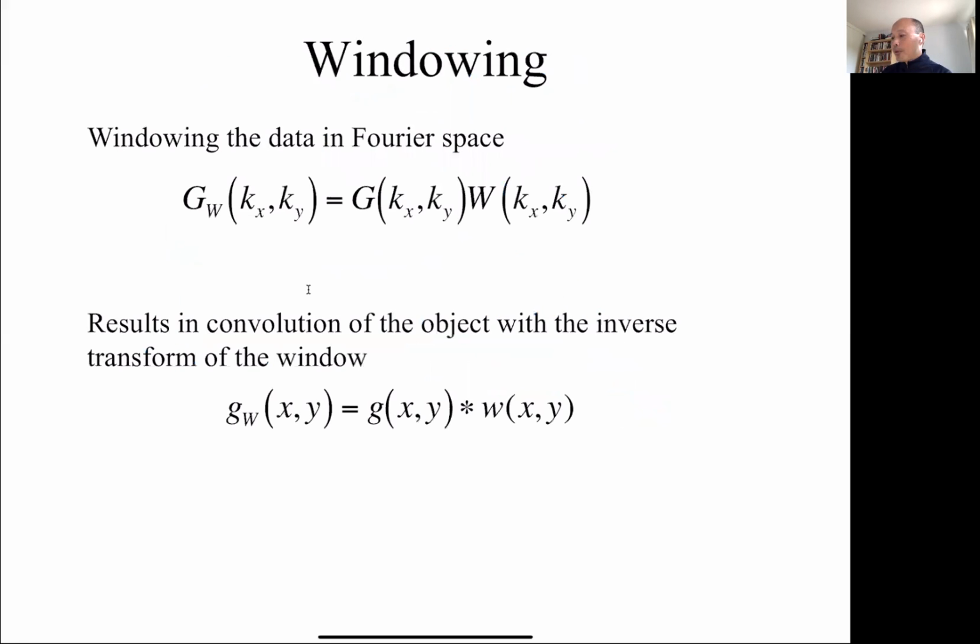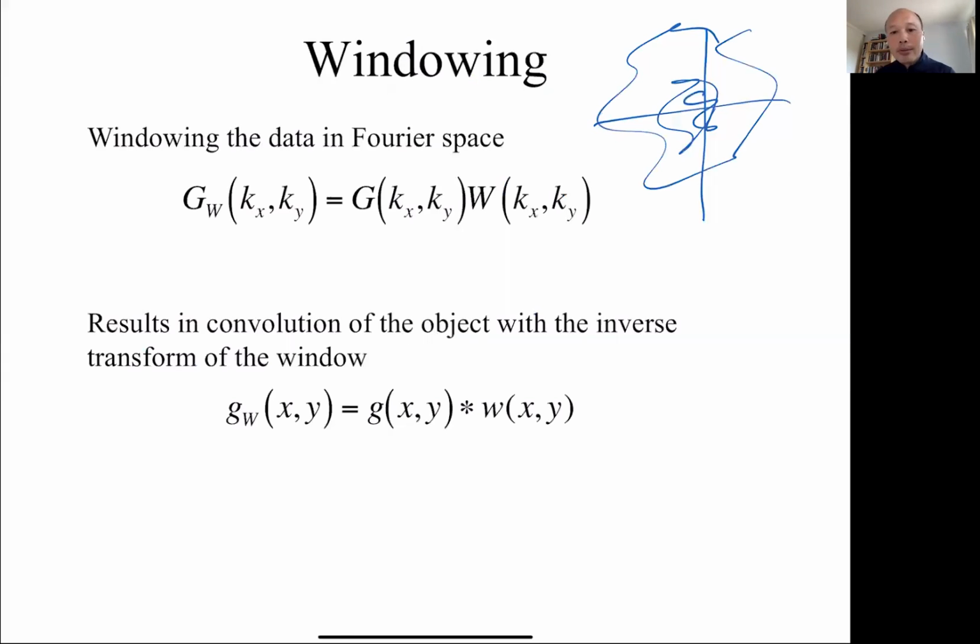So what we're going to talk about next is windowing. And so windowing in K-space just means that if we have some Fourier transform, the Fourier transform goes off to minus infinity and plus infinity. And so we're not going to, in general, want to spend the time to acquire all that data because, in general, we want to acquire the images as quickly as possible. Certainly in an emergency room case, you're always concerned about getting the patient on and off the table as quickly as possible.